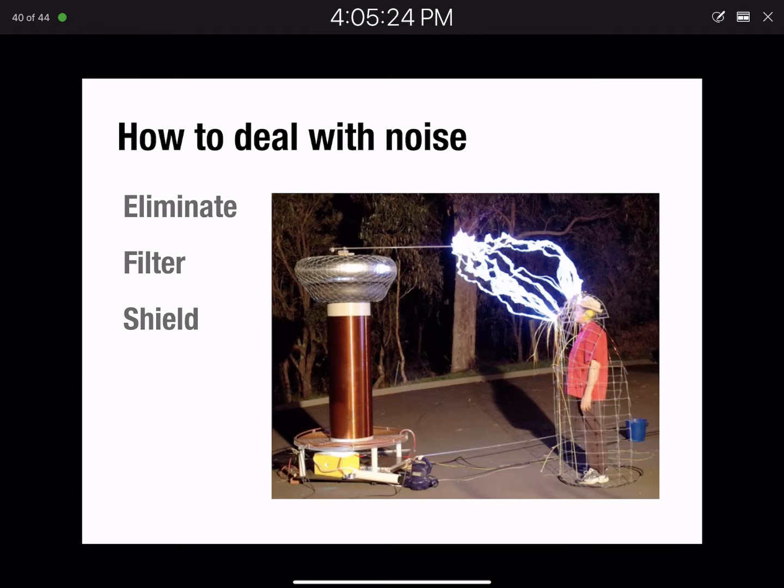So you can either spend a lot of money to minimize the signal that you can otherwise take care of by filtering for the most part, or you can just control your environment as well as possible and do some post-processing afterwards. It's not universally the case, and I've known people who, just through bad luck, had their ERP systems in situations like hospitals, where there happened to be big medical equipment around that did generate big electromagnetic noise.